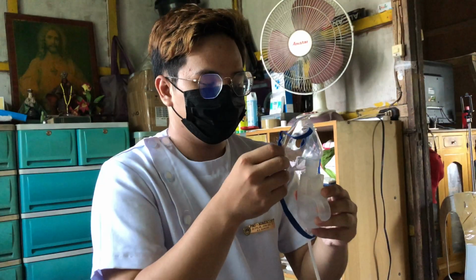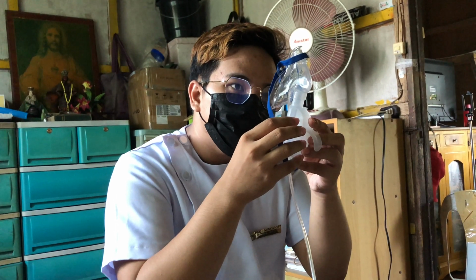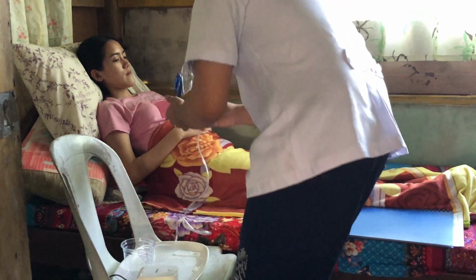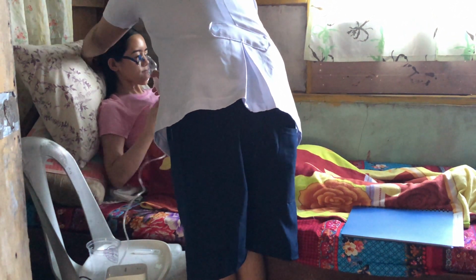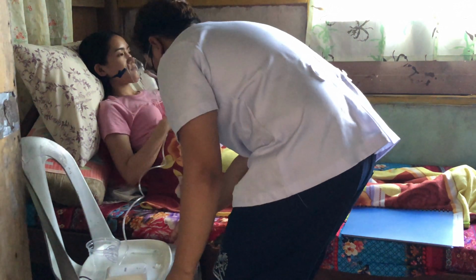Turn on the air compressor. Observe the fine spray from the nebulizer to check the equipment is working. Encourage the patient to breathe the nebulized vapor through the mouthpiece or mask. Breathing through the mouth, or normally with a mask, helps the medication travel to the lungs for maximum effect.